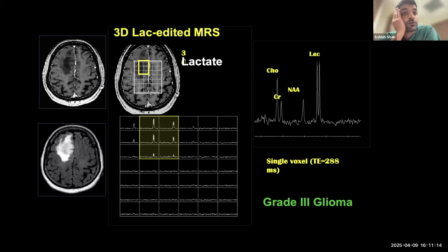Absolutely. And then the last question I had to follow up on that was the utility of MR spectroscopy to detect immune infiltration in the settings of infections and different types of immunotherapies now that we're treating people. Has that been looked at before? Yes. So again, as I shortly alluded to earlier, spectroscopic results are non-specific. You use the NAA and the choline, they occur. Lactate and lipids are also observed in infections.